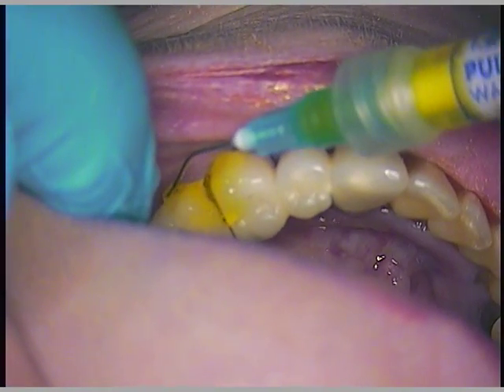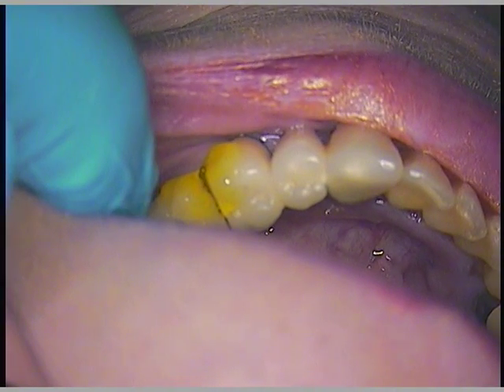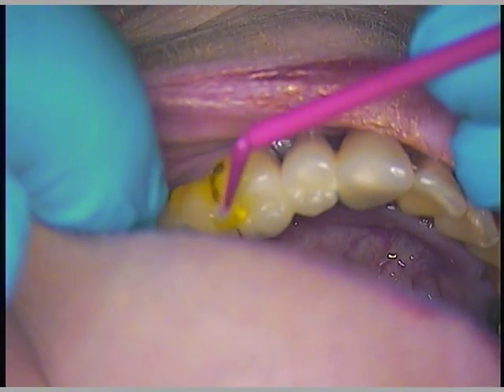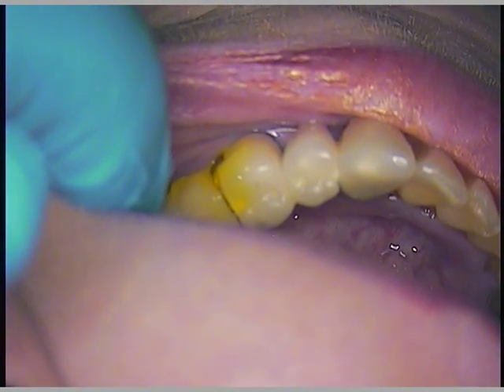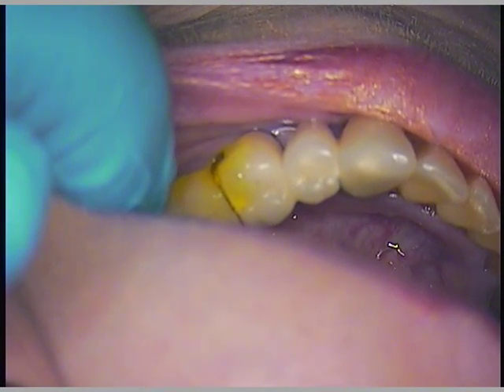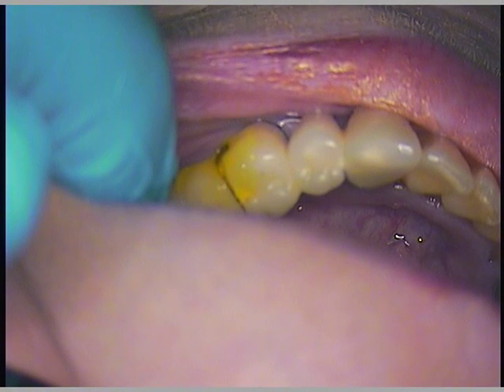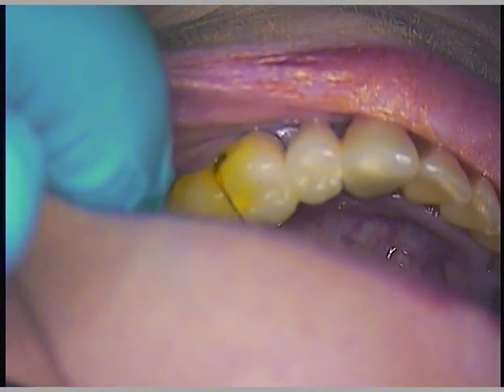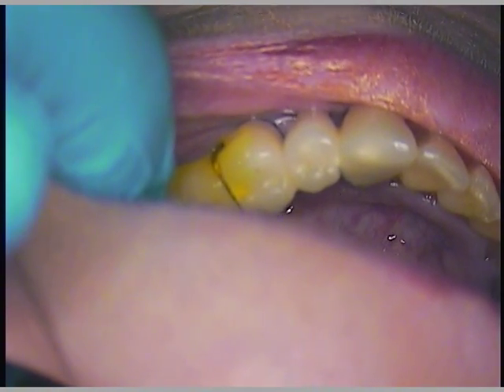Are you okay? Good. Transferring. We'll let that penetrate. I'll pick this up on the next clip when we return.